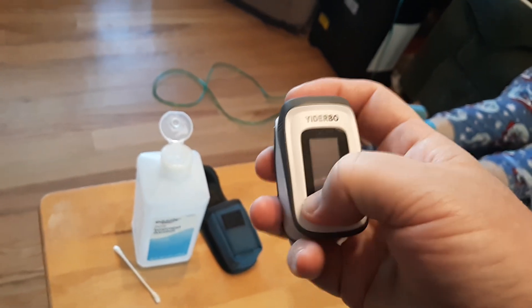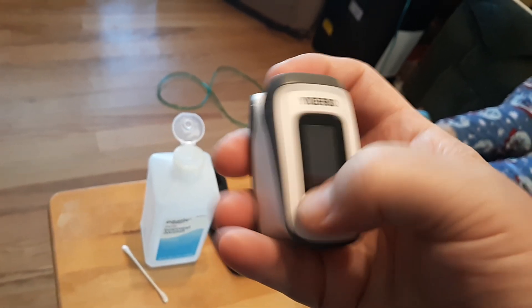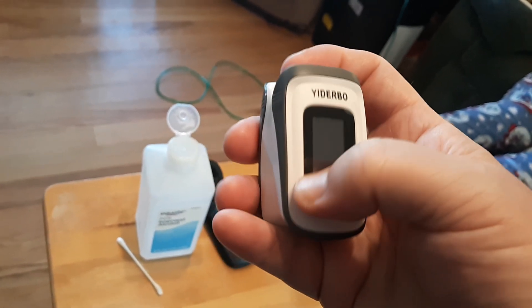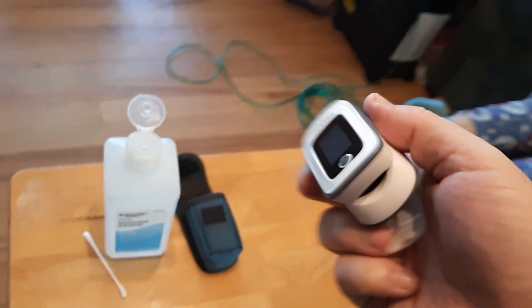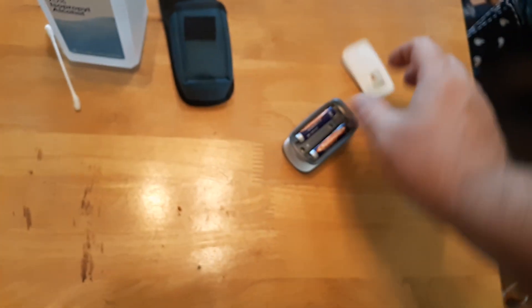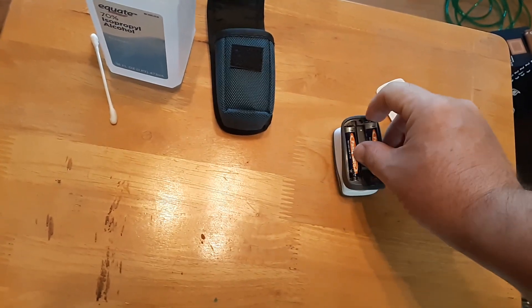If that doesn't work, I want you to press down multiple times on the battery very firmly to see if that will get it to work. A lot of times it will, and if you've tried that with fresh batteries and it still doesn't work, there's a good possibility that you have corroded battery terminals.